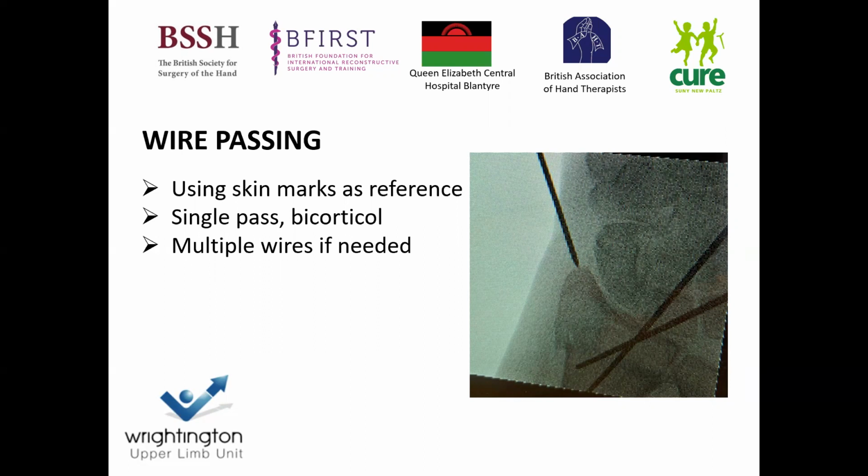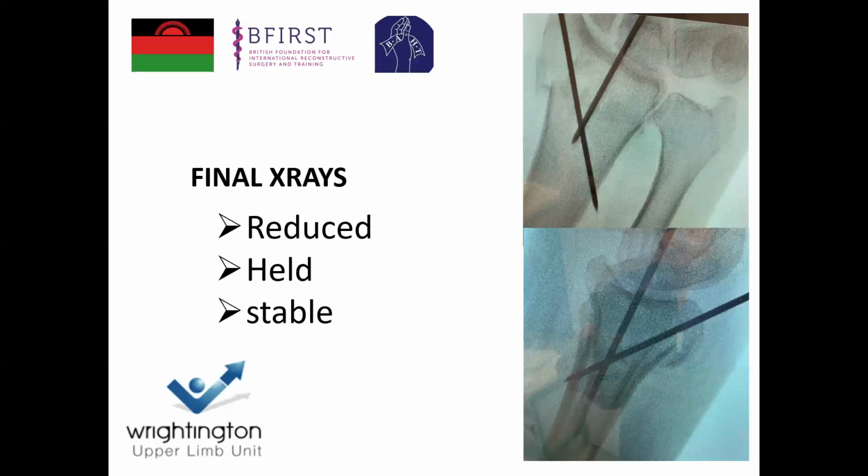And if I'm concerned, similar to distal radius fixations with plates, if I'm ever concerned about my fixation technique, I would either reposition a wire or add another wire to it. I have no issue with adding multiple wires to stabilize these complex fractures if need be. But if I find I'm struggling to fix it with K-wires or hold it with K-wires, then it may be that you've chosen the wrong option for it and you should consider a plating.